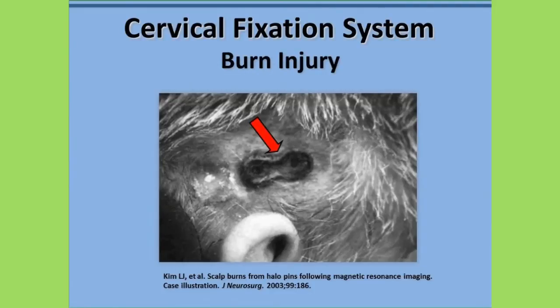Now take a close look at this serious injury which occurred in a patient wearing a cervical fixation system. During the MRI exam, this patient received multiple burns at the points where the titanium pins from the fixation device contacted his skull. This illustrates the fact that extra care must be taken to ensure patient safety when scanning patients with external fixation systems. You must always follow the FDA-approved labeling and specific guidelines for a given external fixation device.